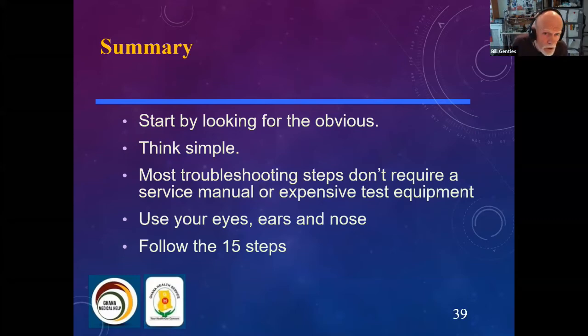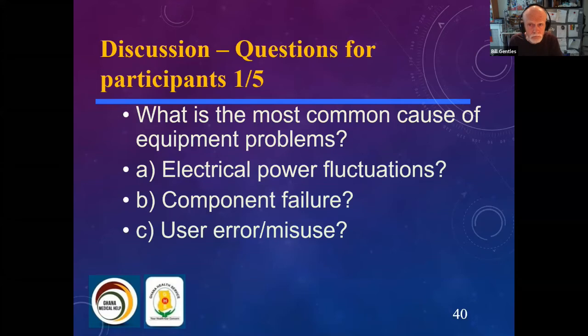Just in summary, start by looking for the obvious, think simple. Most troubleshooting steps don't require a service manual or expensive test equipment. Use your eyes, ears, and nose. Follow the 15 steps. And with that summary, we'll now hand it over to Martin.